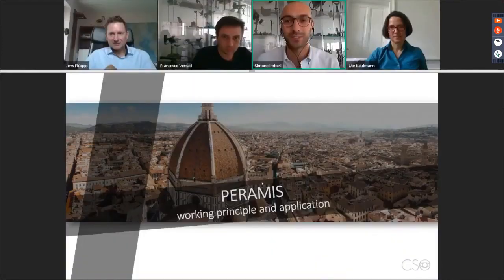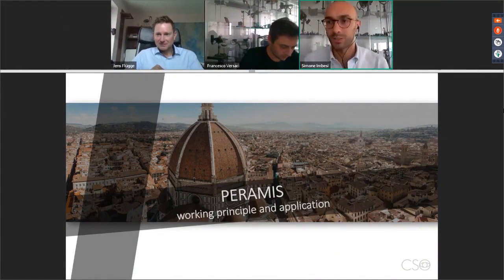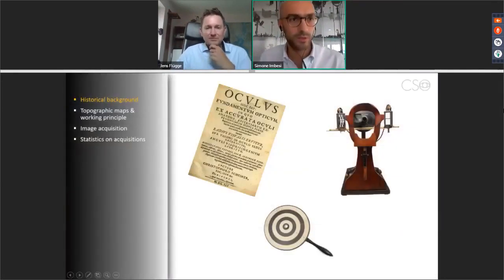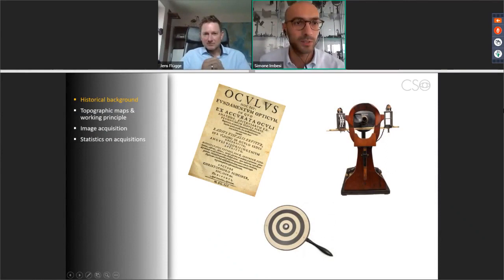My colleague Francesco talked about corneal total aberrometry. I'm going to talk about the topographic part of Peramis. So first of all, let's do a little historical background.